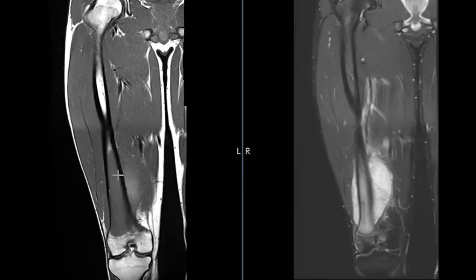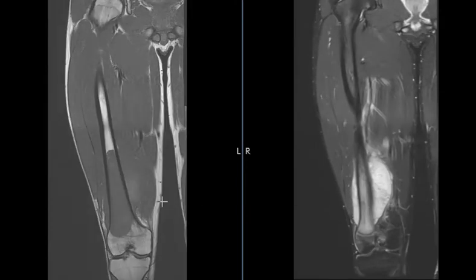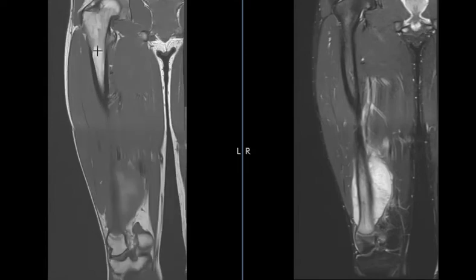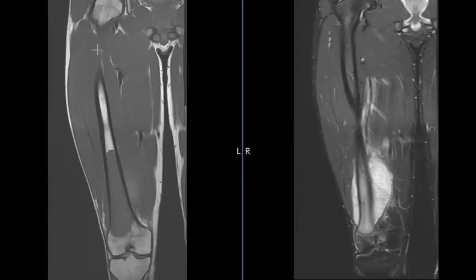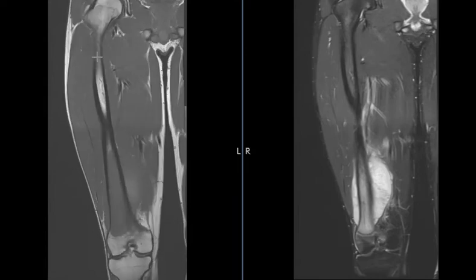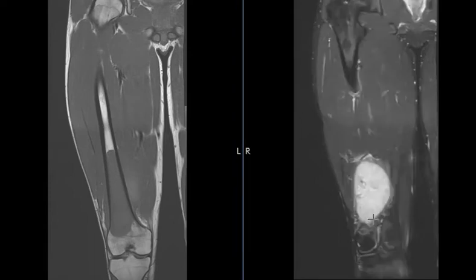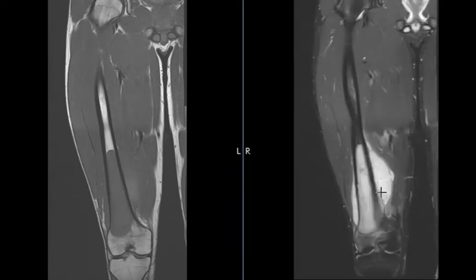This is called a T1-weighted image. The marrow should be bright on this — anything fatty is bright, and the marrow has lots of fat, so it should be bright. Right here we see the marrow is replaced and it's dark. So this is the same bone lesion, just a different sequence.